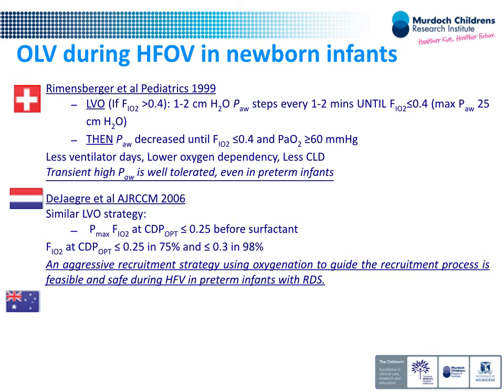Or leave the baby on a low mean airway pressure on a high frequency, which we know is not the optimal way to treat these babies if you want to get the full effect of lung protection. So this is some of the reasons why we opted to, as soon as the tube is in there, not bag them, put them on the oscillators, recruit the lung, stabilize the lung, take the X-ray, and then treat with surfactant and we down the pressure.